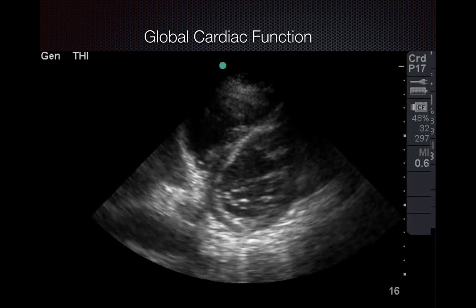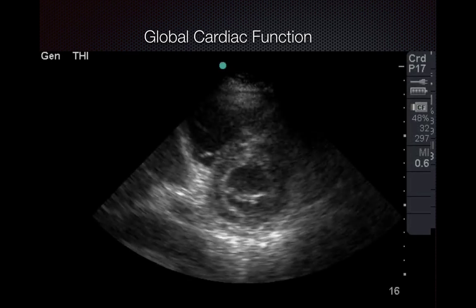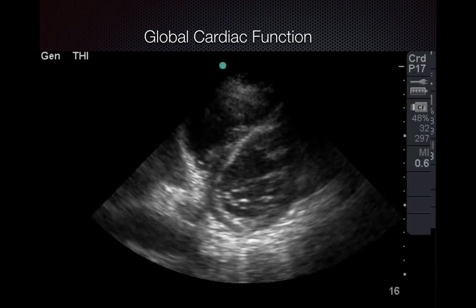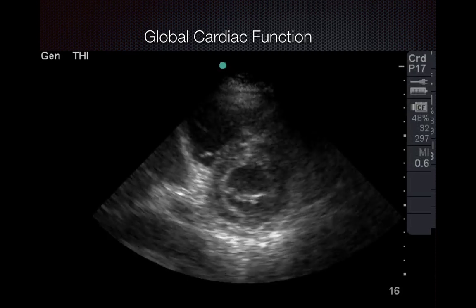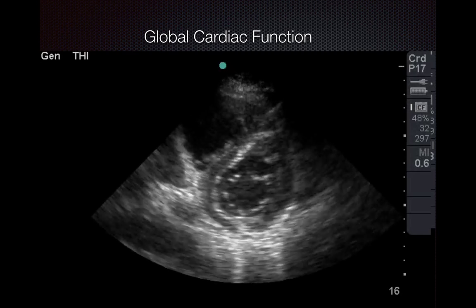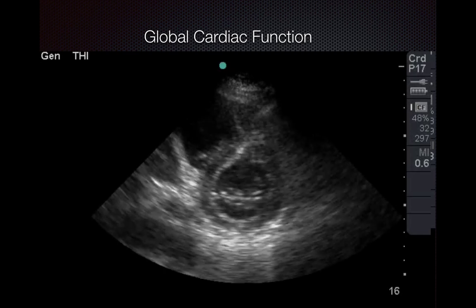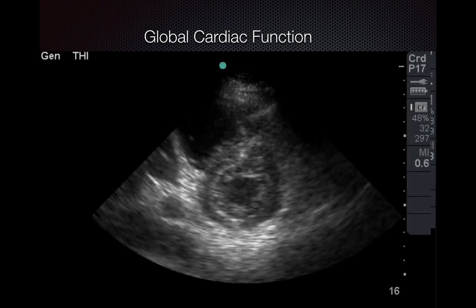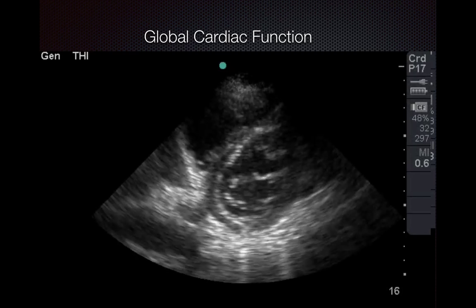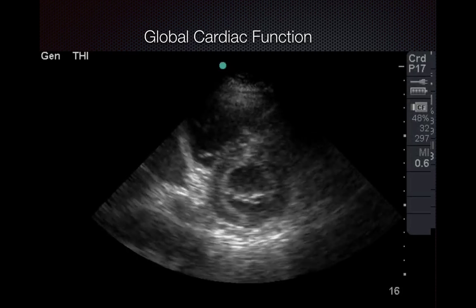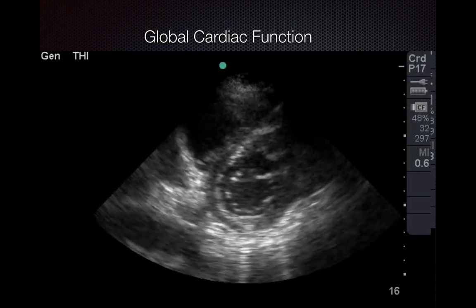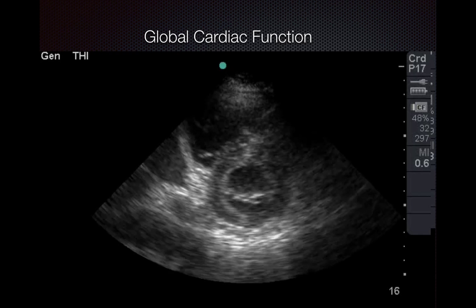Here's a parasternal short view of a heart with a normal EF. You can see the left ventricle is contracting symmetrically and everything is thickening together. Usually we would be a little bit lower than this, just at the level of the papillary muscles. But when it's normal and you see that change and that thickening so symmetric and even, that's reassuring.